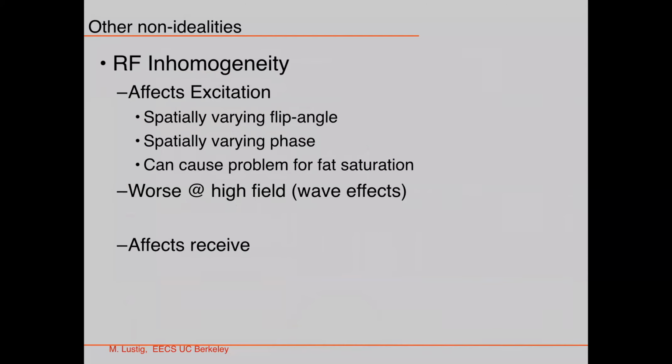Anyway, each one is 5 seconds. Then basically, in the second case, you have that 10-second window in which you collect information. And if something happens during that 10 seconds, it's more likely to happen as opposed to 5 seconds each. So I agree with you that it could be more sensitive. Okay, thank you. But the benefits are significant. It actually increases with the square root of the number of slices. And we'll talk about that when we talk about SNR. Thanks.